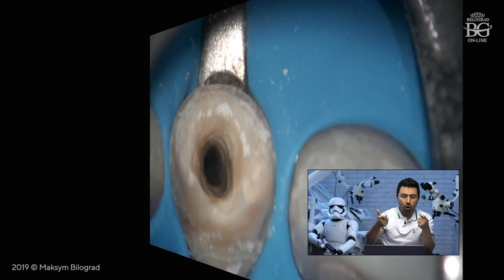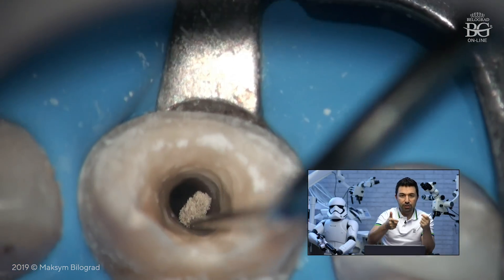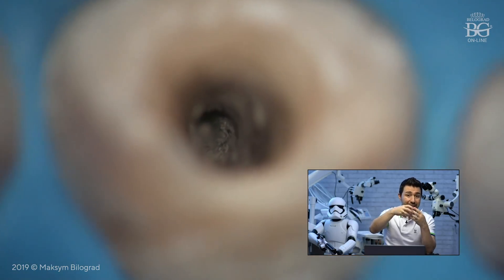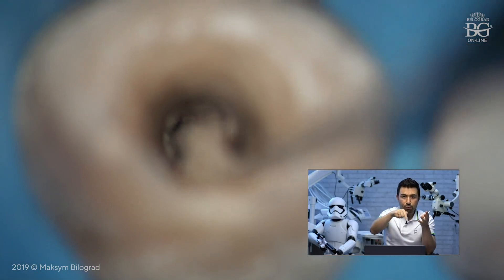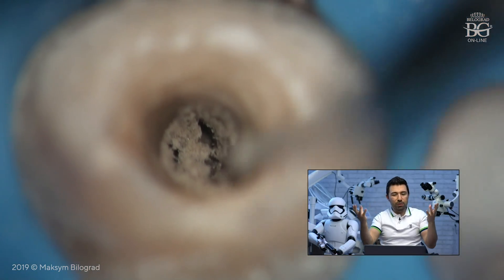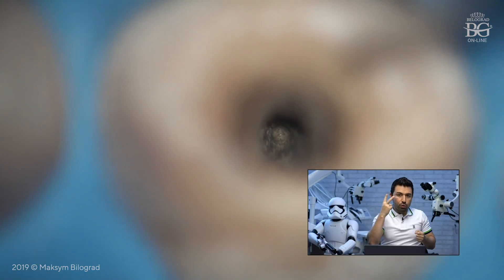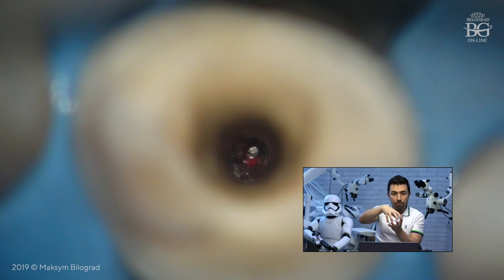How do you hold the powder with instruments? Take your hand plugger, dip it slightly into distilled water or anesthetic, then pick up the powder and put it into the root canal. It will not be accurate — powder will be all around the root canal walls, but it is easy to fix. Take a paper point cut to make it thick, or take a really thin endodontic microbrush, and move the powder from the canal walls down toward the apex. This first portion is unmixed MTA, which will then get moisture from the periodontium and from the calcium hydroxide and begin to auto-mix.